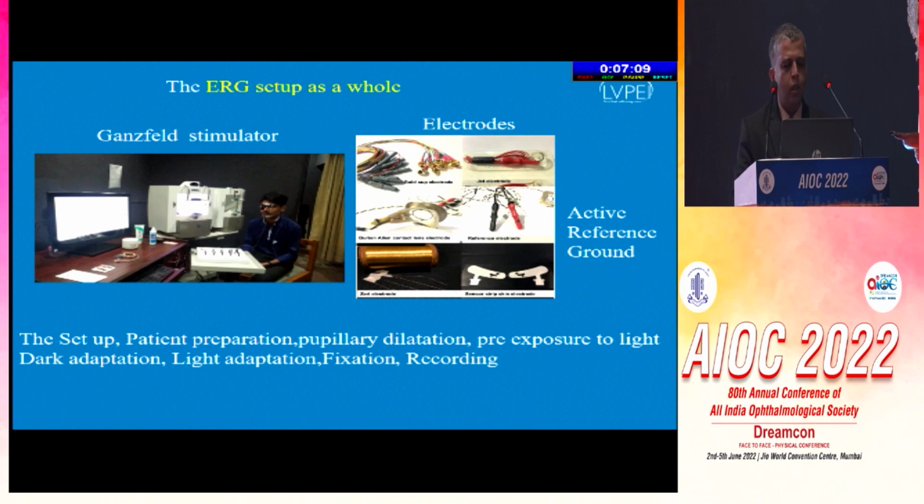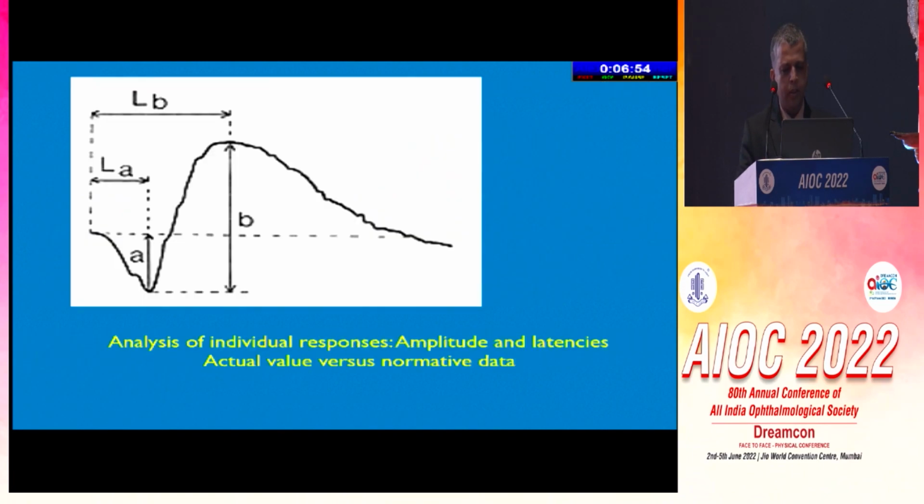Fixation: the full-field ERG is a test where cooperation is not that essential. Even in those with nystagmus and poor cooperation, the responses can be collected. Now this is how the waves look.